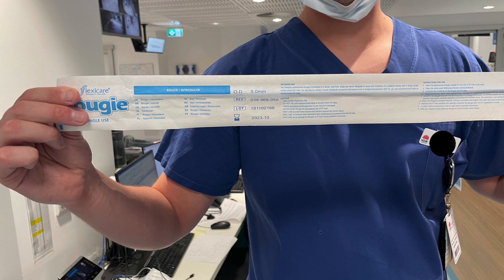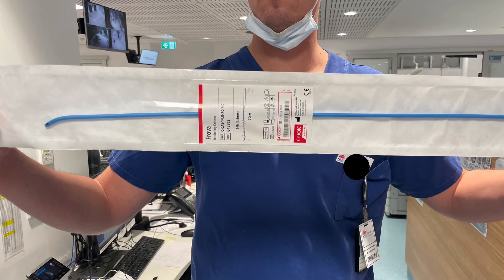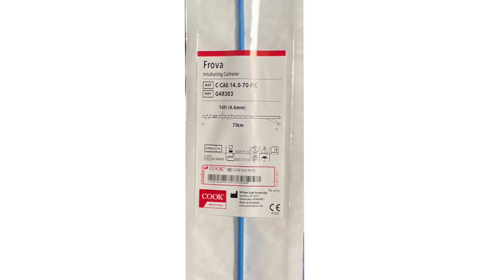Other problems with the FlexiCare include not maintaining its shape when you try to mold it. Personally, I would recommend the Frova based on my own experience. But the key learning point of this video — whether you've got Frovas or not — is to make sure you know what bougies you have in your particular area and what you're able to do with them in terms of manipulation and shaping, because they are not all made equal. Thanks for listening.